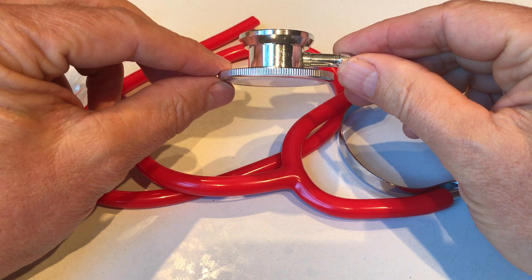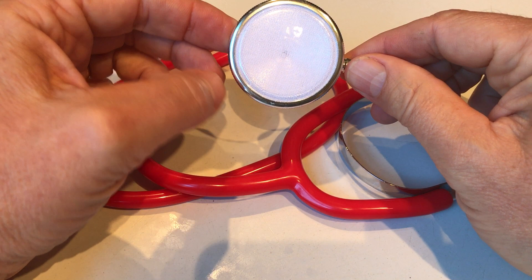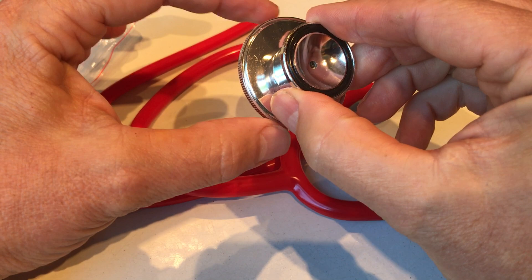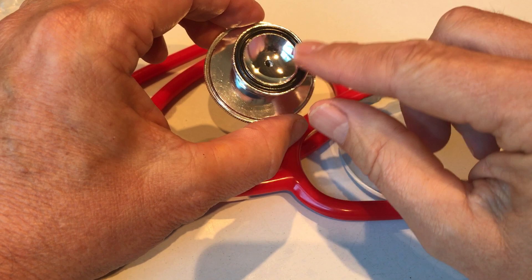This is a double-head chest piece fitted onto the other side of the tubing. You've got a standard dual head — this is called a Bellen diaphragm model. It's adult size, approximately five to five and a half centimetres across. This is the diaphragm side with the diaphragm in place; it comes ready constructed. The diaphragm can be removed by unscrewing the diaphragm ring. On the other side you've got the bell side with an anti-chill ring in place.